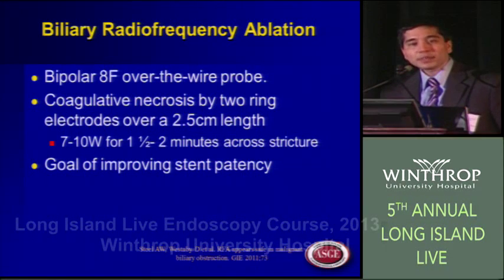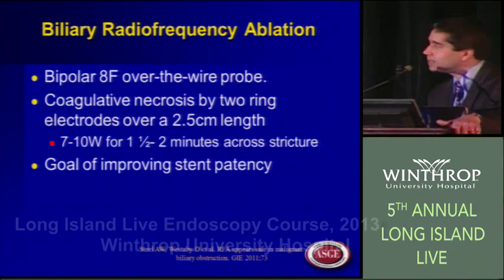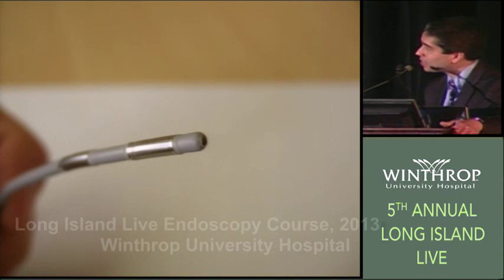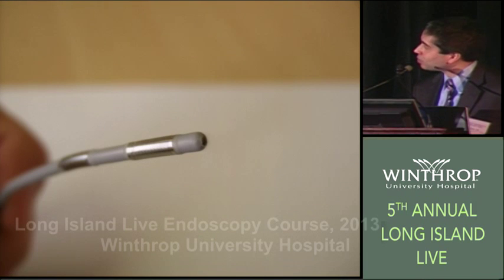And radiofrequency ablation for cholangiocarcinoma, I think, is one of the interesting novel techniques now. It's a probe, and I have a picture of it here. Two electrodes provide a coagulative necrosis over approximately 2.5 centimeters. And this is over the wire. So there's a little hole here.